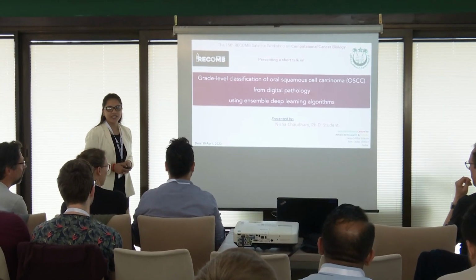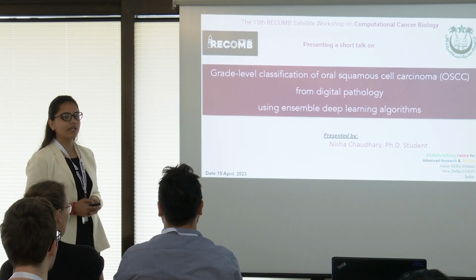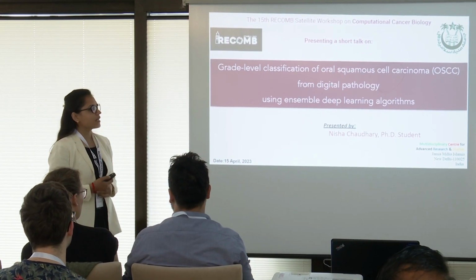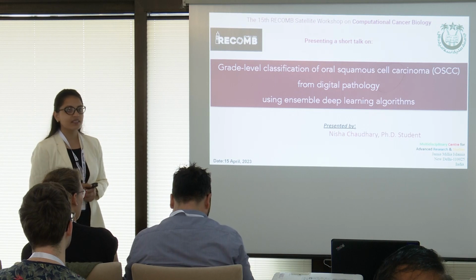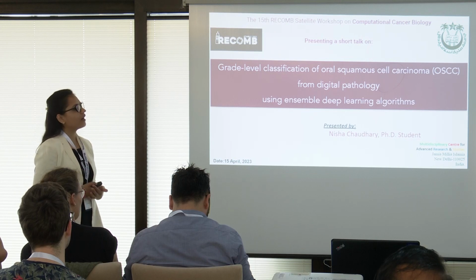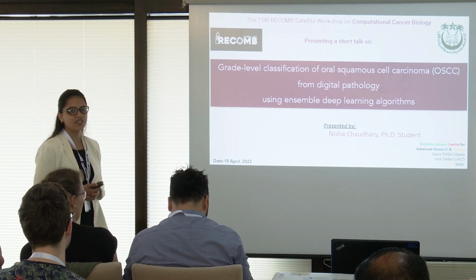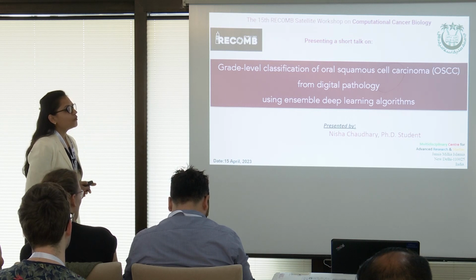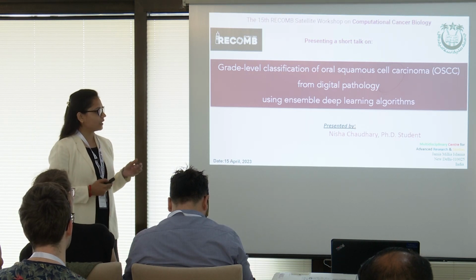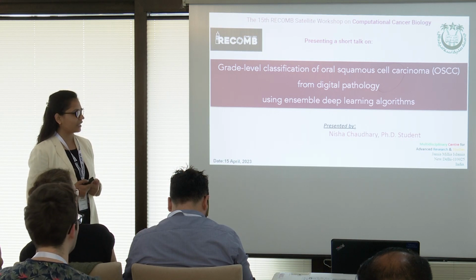Oral cancer affects around 3 lakh people every year from different countries, especially South Asian countries where people have the habit of chewing tobacco, pan, gutka, etc., due to which several pre-malignant and malignant conditions arise. As we all know, the diagnosis of most cancer conditions is done by the histopathologist based on tissue samples. To diagnose oral cancer, they take tissue biopsy samples and analyze them under the microscope to perform the final diagnosis.